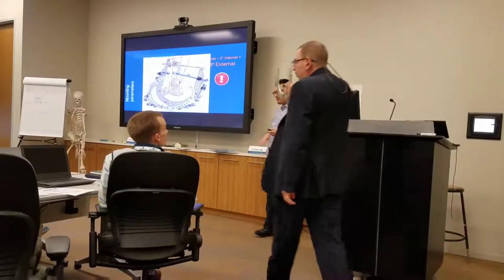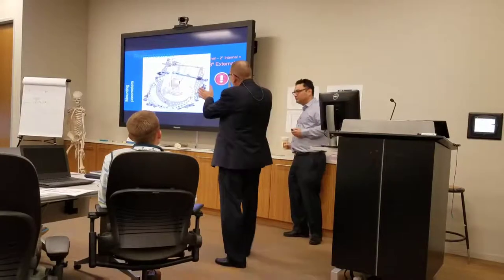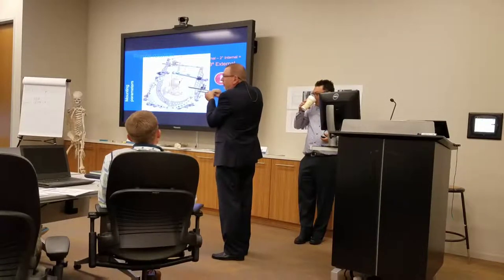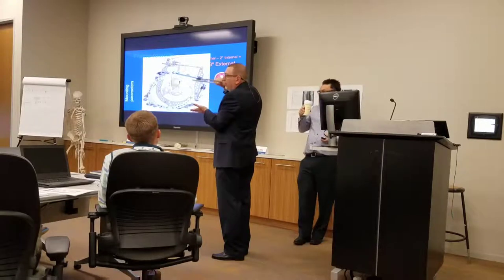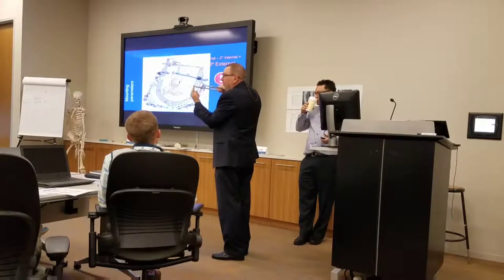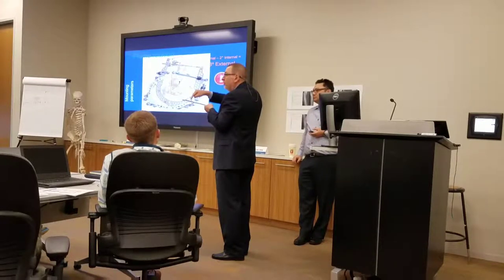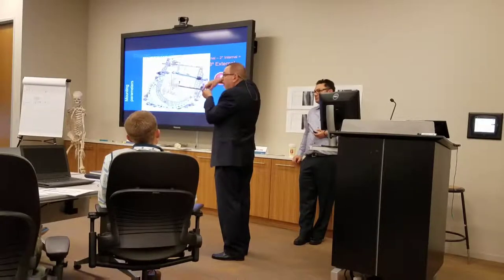This is your proximal support, right? Doesn't matter how you put it, it doesn't matter for computers. If this is your proximal support, where should your struts 1 and 2 be? Right here. There's nothing here. So because there's nothing here, you have to use any other tab. Now, if you try to use this tab, you can. But if you take a ring, this tab is actually not matching the ring. So if you try to do a 60 degree rotation, not the easiest way, just turn everything around.